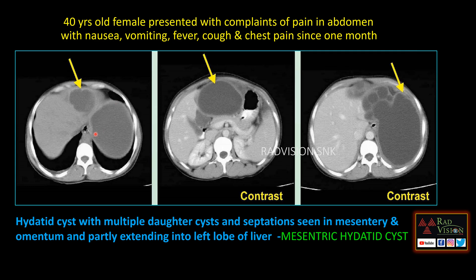Next case: a 40-year-old female with pain in the abdomen, vomiting, fever, and cough. You can see there is a cystic lesion in the left abdomen with multiple daughter cysts within the mesentery, extending anterior to the stomach and even into the left lobe of the liver. This is a mesenteric hydatid cyst.